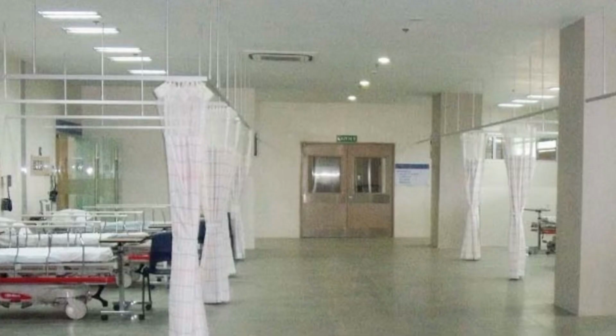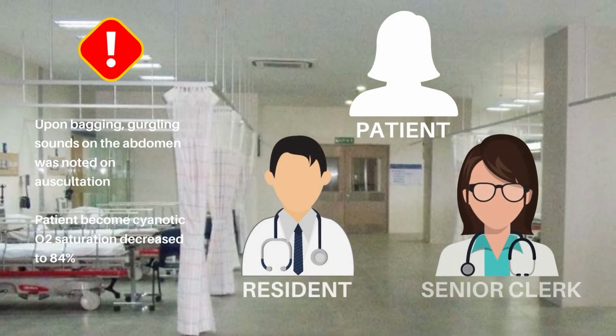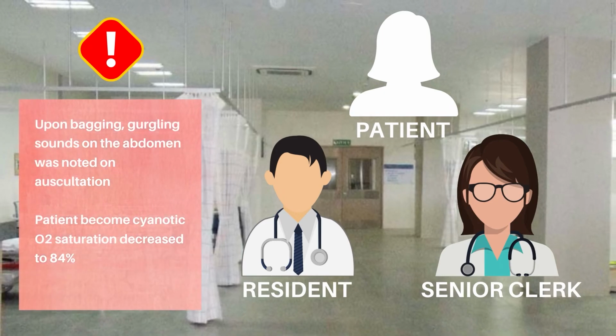But what happened in the case is that after intubation, the resident double-checked the tube placement, since upon bagging, gurgling sounds on the abdomen were noted on auscultation. The patient became cyanotic and oxygen saturation decreased to 84%. What should we do next?